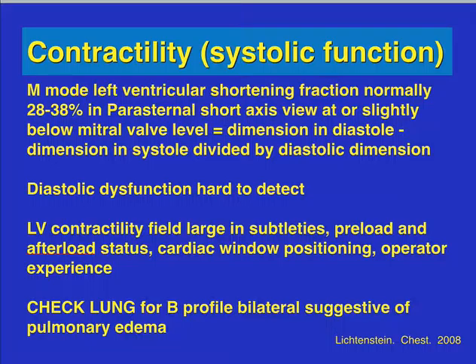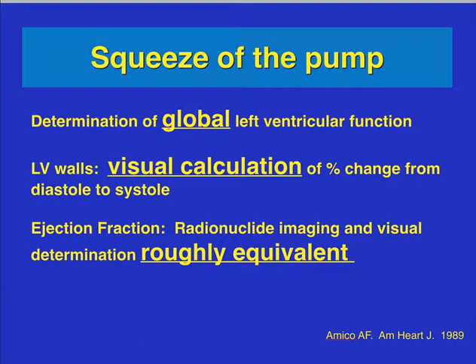The perfect example is sepsis. In patients in early sepsis, they're hyperdynamic and can tolerate large amounts of fluid. But shortly afterward, within 12 hours, 24 hours, typically the patient at some point becomes fluid overloaded. And at that point, the patient may benefit more from vasopressors or inotropic agents, depending on your ultrasound findings.